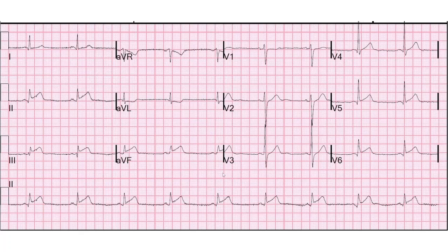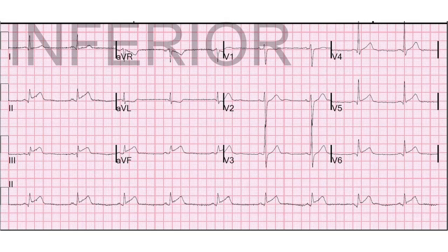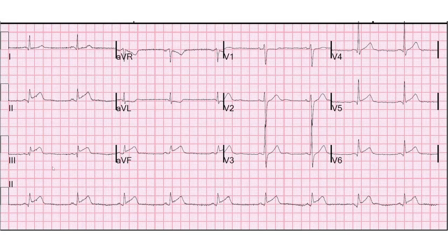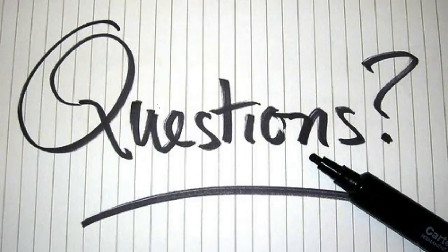An inferior STEMI. Leads two, three, and AVF — you can see the elevation. You can see some reciprocal depression in AVL, not as much in one, but we don't need it in both — we just need elevation in the inferior leads. Reciprocal depression is a confirmation, but if you had an inferior wall MI from a distal blockage of the left anterior descending, you wouldn't have reciprocal depression but it would still be a STEMI requiring a cath lab and an interventional cardiologist. If you have questions, you can put them in the comments or email me at shadetreecardiology.com.